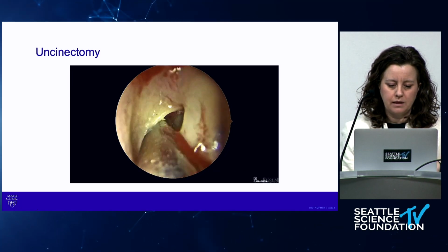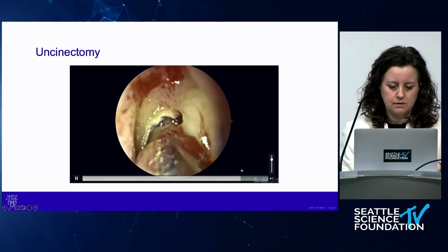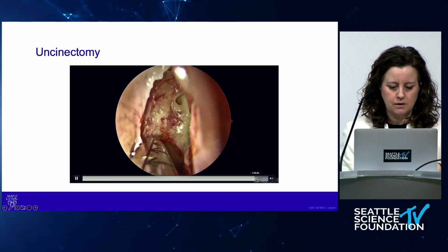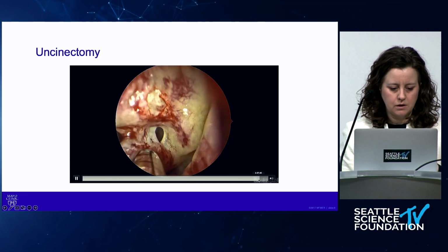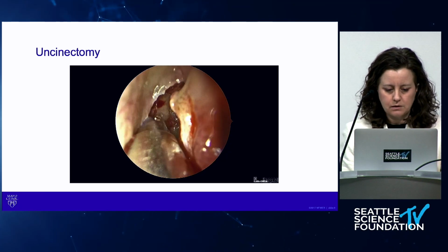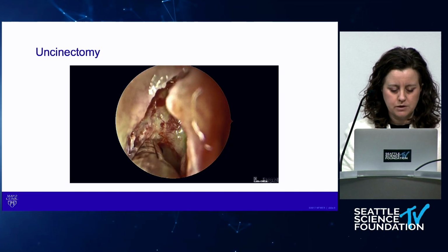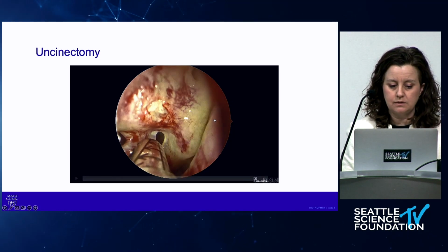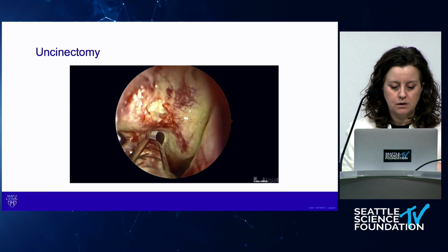But we want to take that all the way to the maxillary line. The reason this is so important is that you want to be able to see that ethmoid bulla, which is behind us there. And we'll see here, there's the natural os. I realize this is cutting into how to do a maxillary antrostomy, but like I said, to have a good ethmoidectomy, you want to be able to see this is the bulla, there's the lamina.